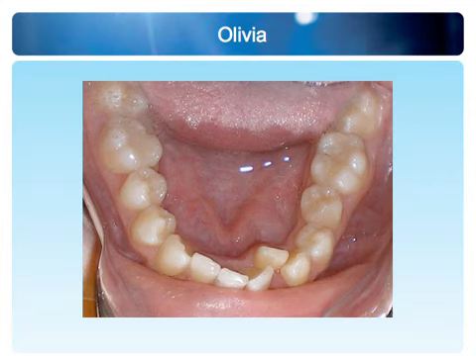There is teeth leaning in completely, and they are totally derotated. The width is narrow, both upper and lower, and the arch form is wrong. So we have improper arch form, improper arch width. We need the buccolingual inclination addressed, and the good news is we don't have large teeth, so we should be in good shape.